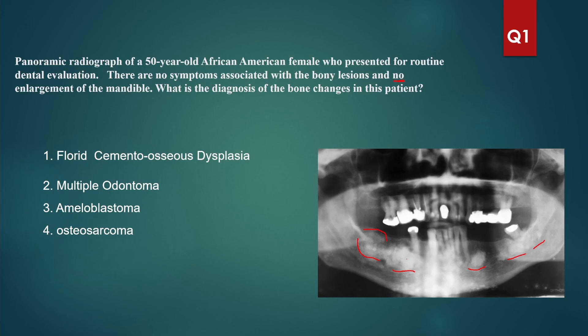You see this hole here — around the mental foramen — but I don't see any cystic areas. So this is definitely not ameloblastoma. This is not odontoma. In osteosarcoma, there will also be enlargement of the bone most often. So the only answer we are left with is florid cemento-osseous dysplasia, because it's generalized all around in the mandible.